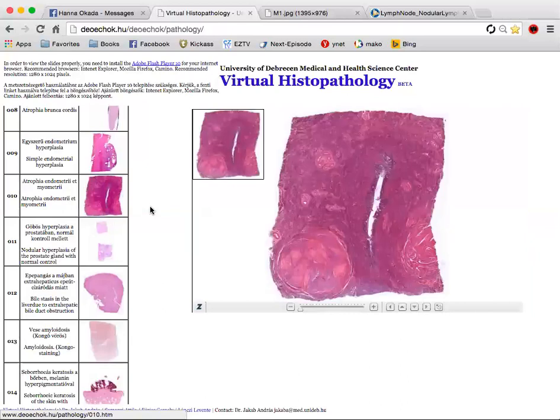So the next slide is also of a uterus, but this is the complete opposite. So this is atrophy, and here there's a lack of hormonal stimulation, so maybe this is a postmenopausal woman. But there's also a region of hyperplasia here, and this is a leiomyoma. It's in the myometrium. You're also going to have a separate slide about it, but this is a smooth muscle tumor, a benign tumor. So I'm going to start with the atrophy.